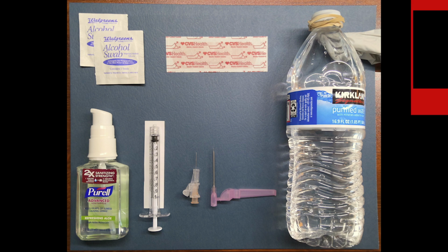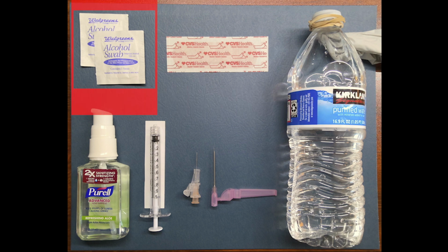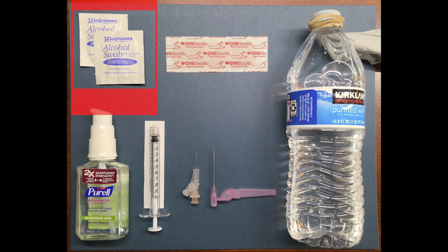Alcohol swabs to clean your skin where you're injecting, and also to clean the medicine bottle prior to drawing up the medication. A 1 ml syringe. Depending on your dose, a 5 ml syringe can work in a pinch. An 18 gauge needle to draw up. You can use any size needle to draw up the medicine, but the lower the gauge, the wider the needle, and the faster it draws up. A 25 gauge and 5/8 inch needle to inject with.